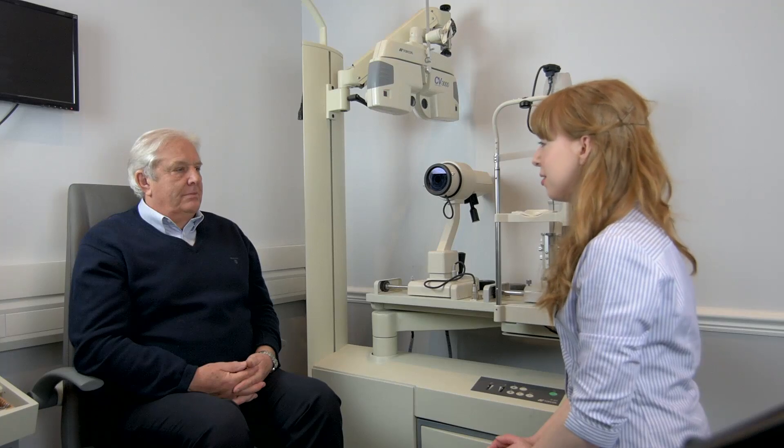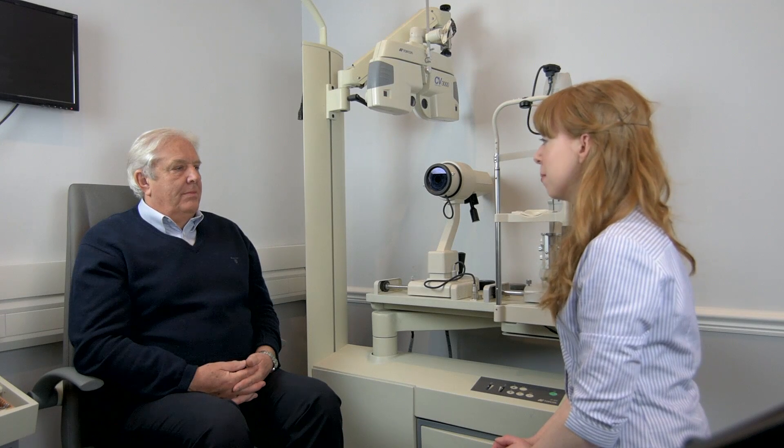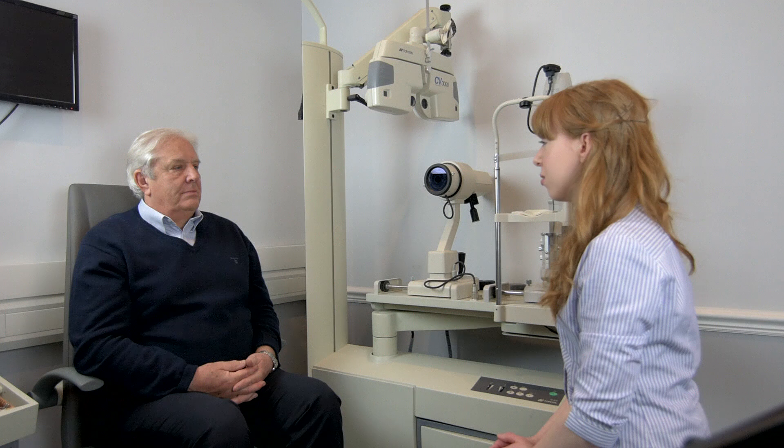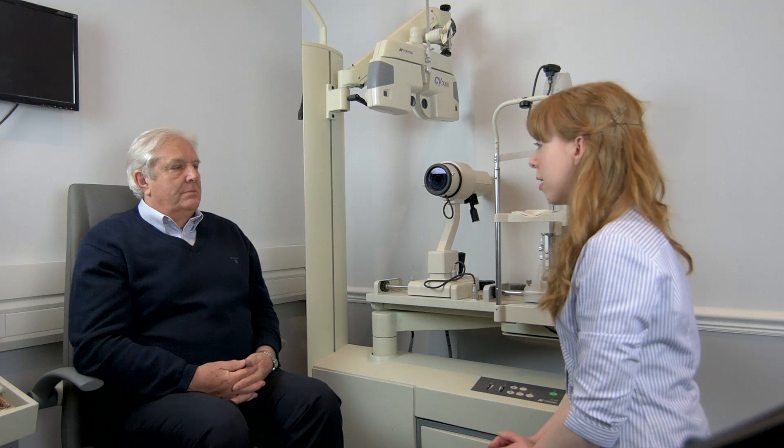I'm Laura. I'm going to measure the pressure inside your eyes today. To do that I do need to put two drops in each eye. One drop just numbs the eyes. The other drop just lets me have a look at the front of the eyes in a little bit more detail. The drop that numbs your eyes lasts for about 10-15 minutes afterwards, so just be aware not to rub your eyes at all.